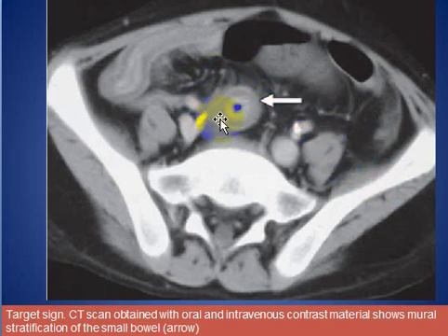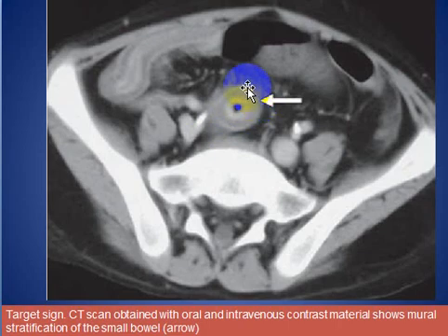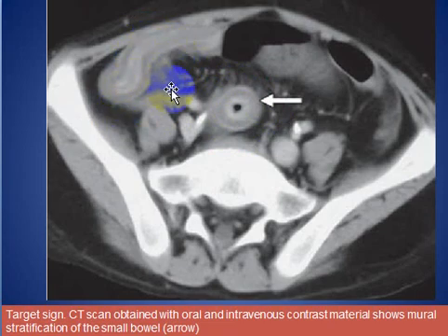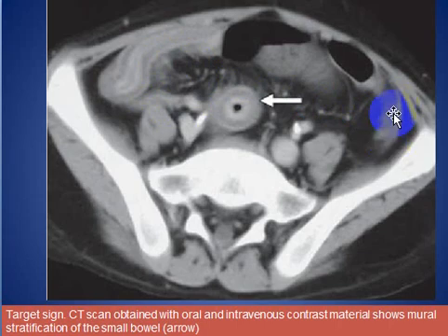Here is another patient with the target sign, obtained after intravenous contrast and water. We see the target sign here, thickening of the small bowel, and some stranding of the mesentery.